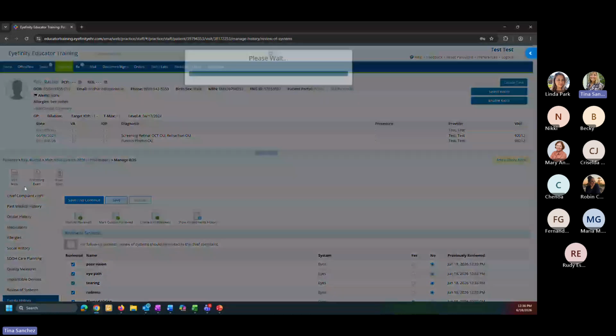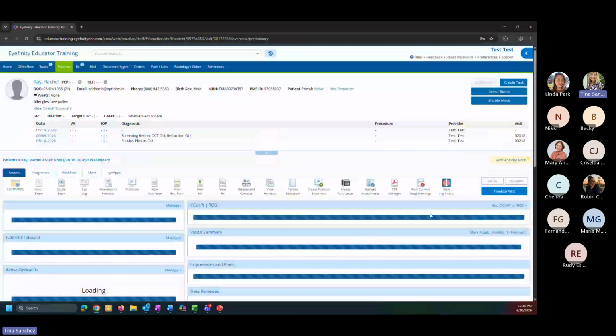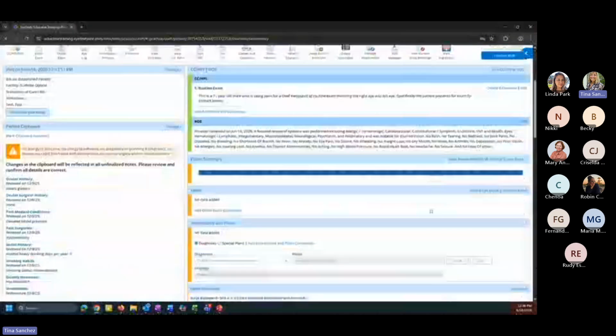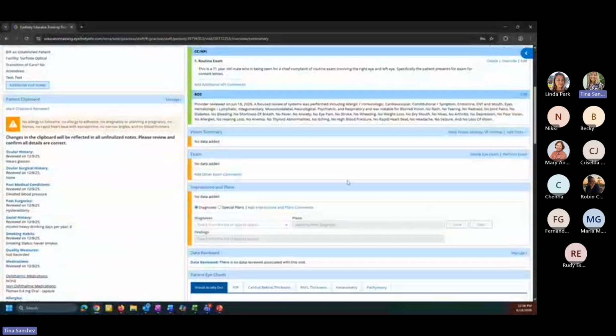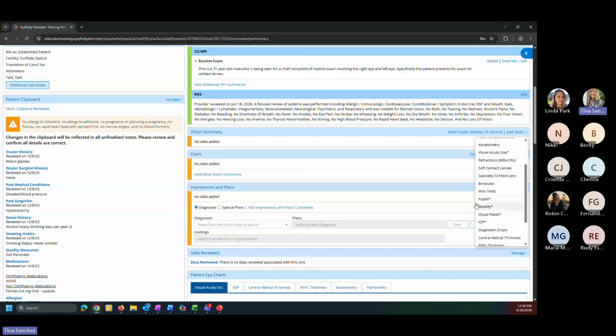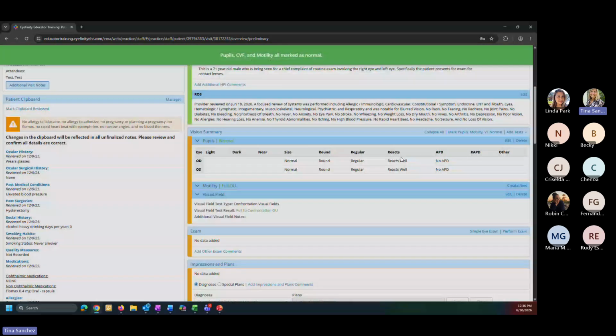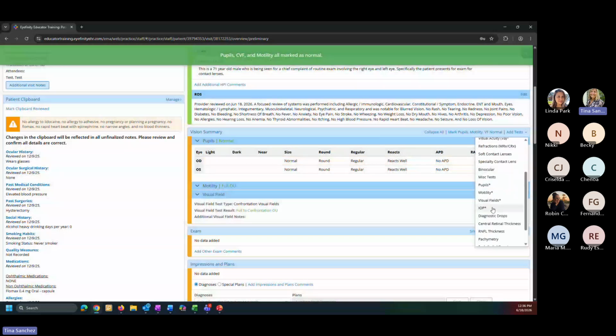All right, so I'm going to go back out to my visit here to bring me back out to my main screen in my visit. So we should see my review of systems there as well. So now I'm going to jump into my vision summary section. I'm going to add my test. I'm going to jump around on here and add in things. So mark pupils, motility, visual fields. Keep in mind you can do that at the same time. I'm going to click that here. So that does those. I'm going to jump in and do my IOPs here.